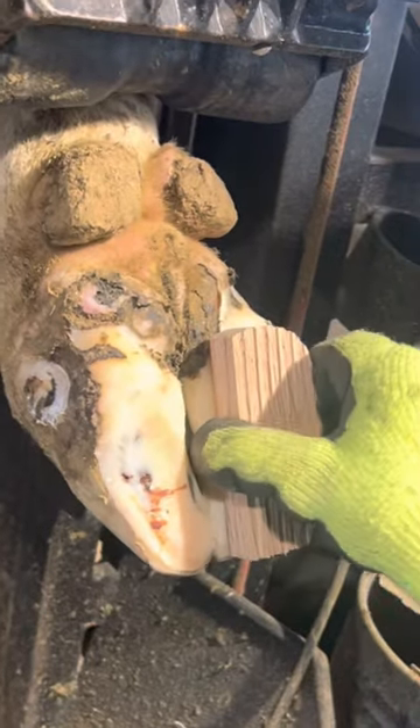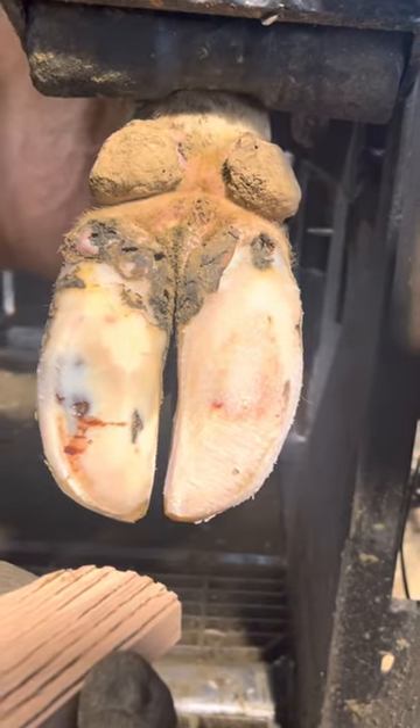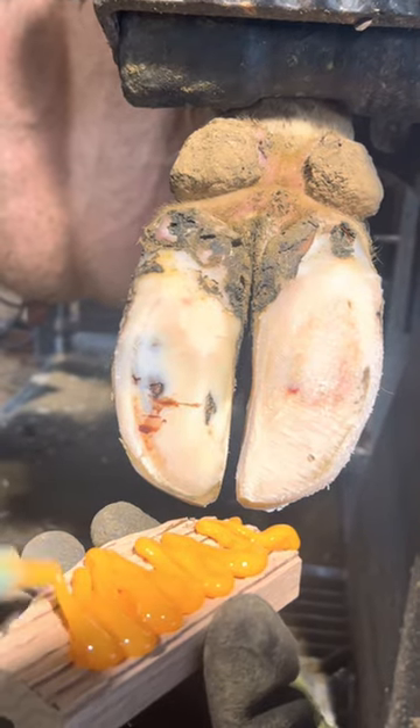I'm going to be using a wood block on this farm — they prefer a wood block because the rubber blocks get stuck in their manure pumps. This block is going to act like a crutch for the cow so that she can put all her weight on this block and not on that lame claw.